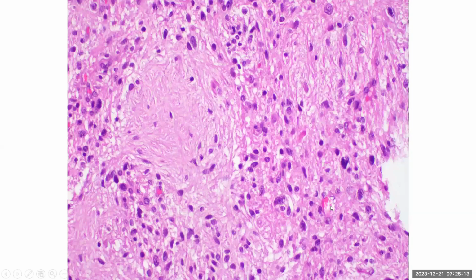Yeah. So again, you see here there are some capillaries. I was wondering if one or two areas on the right half were Rosenthal fibers at all. That could be. There's some nuclear atypia in the same area, like enlargement of the nuclei becoming darker, more atypical.